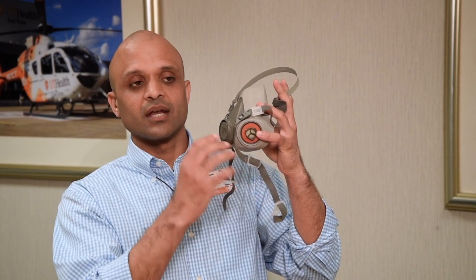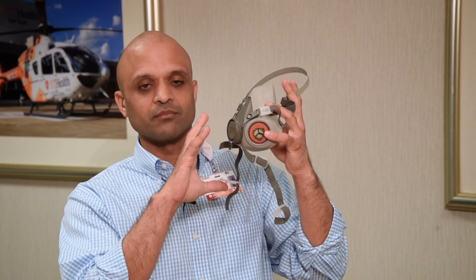This is a reusable mask. We can completely disinfect it after use. I wanted to show you guys some techniques on how you can properly disinfect it without contaminating yourself.